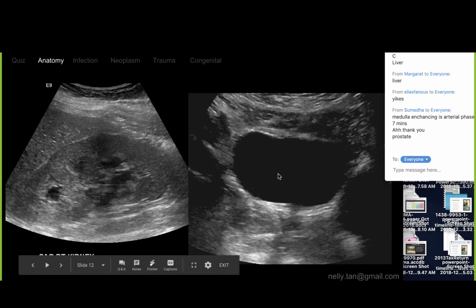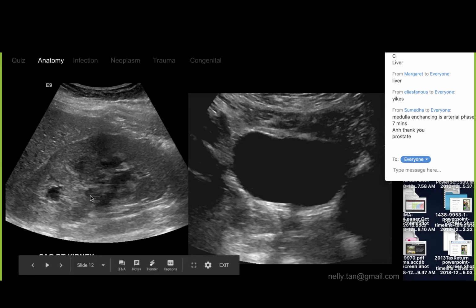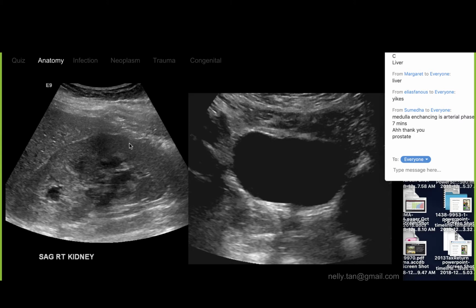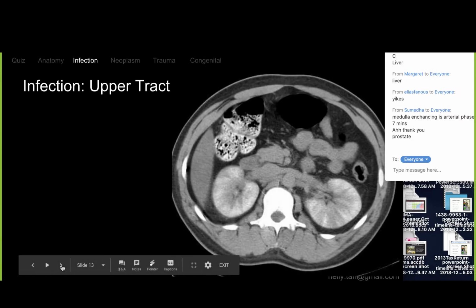Of course, the limitation is that it depends on the operator. With CT/MR, it doesn't matter who acquires the images. You mostly get very standard, high-quality images. With ultrasound, it depends on the technologist and the patient's body habitus. For heavier patients, ultrasound is very hard because you get acoustic attenuation from the really thick soft tissues. So there are advantages and disadvantages, but contrast-enhanced ultrasound is FDA approved for abdominal applications now. So it's an alternative modality for patients.